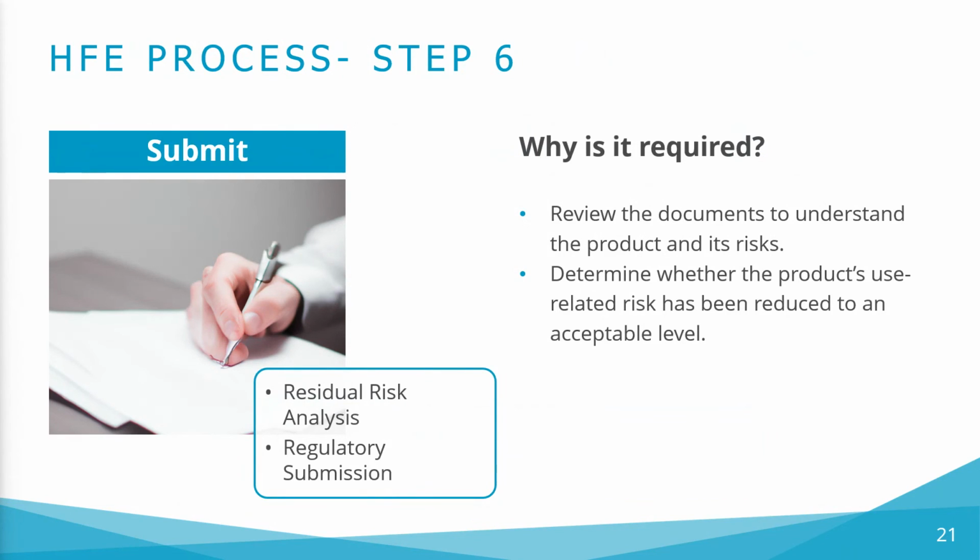Why is it required? Manufacturers demonstrate in the HFE report and usability engineering file that they arrived at a safe, effective, and usable product by applying HFE throughout the product's development. Regulators review these documents to understand the product and its risk, and then regulators determine whether they agree that the product's use related risk has been reduced to an acceptable level. That is, whether the product can be used safely and effectively.